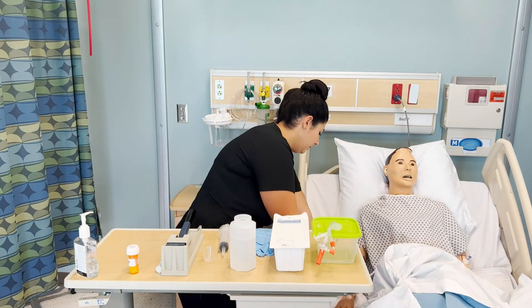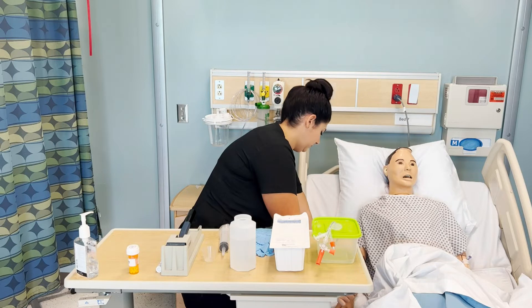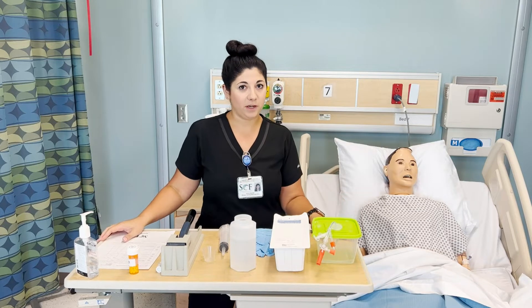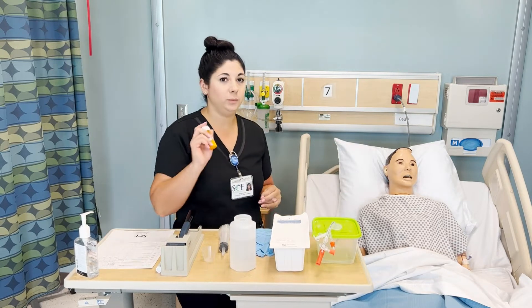Bringing my MAR with me. Can you tell me your name and your date of birth? And do you have any allergies? No. Great. I've already done my first check when I got my medication and my second check in a private place, so I will now do my third check.